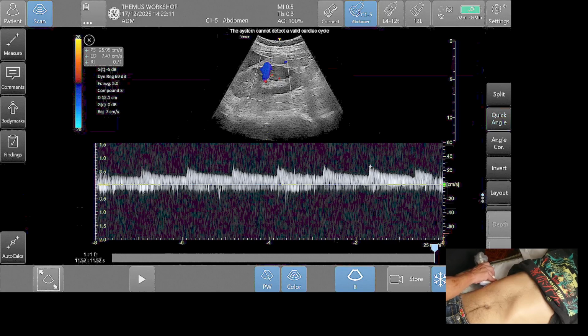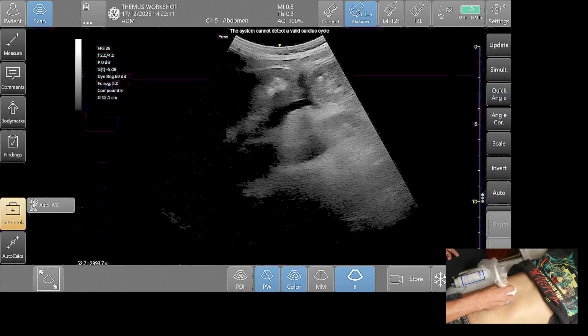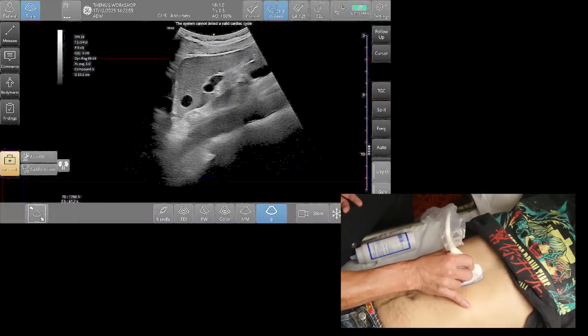So I think the best way is from the side, and then you will sample the hepatic vein, the right portal vein, and even the intrarenal vein as well. Use this side. That will be easier. If the patient has a problem on the right side, then you can sample the kidney on the other side. But I think choosing one side will be much easier compared to the anterior part. All right? Because for the anterior part, even I still have problems getting a good view.